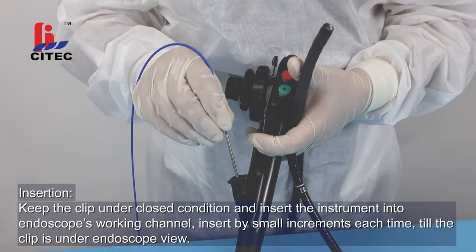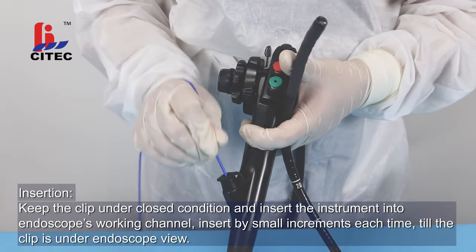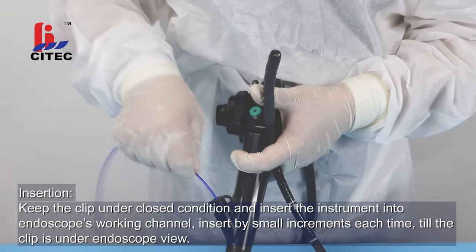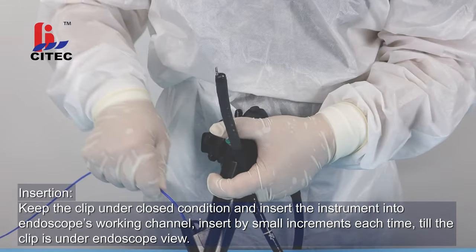Keep the clip under closed condition and insert the instrument into the endoscope's working channel. Insert by small increments each time, till the clip is under endoscope view.